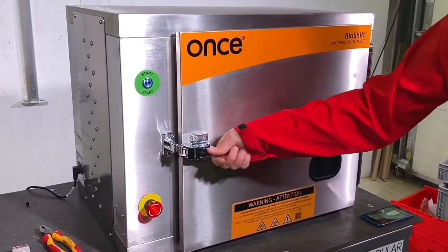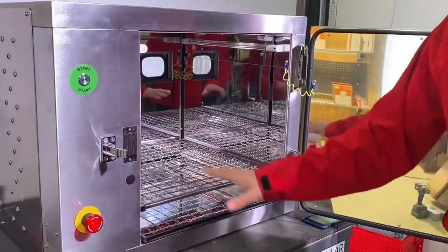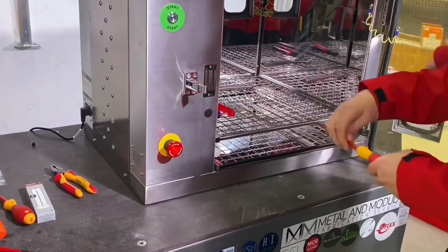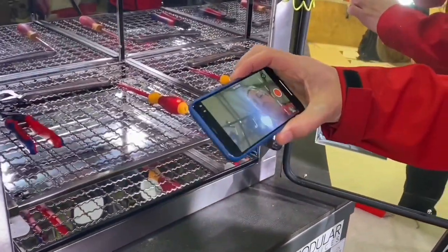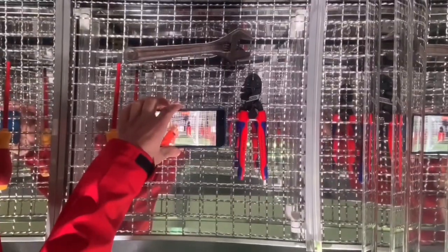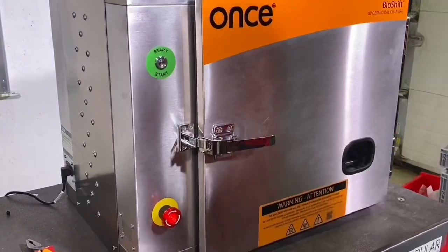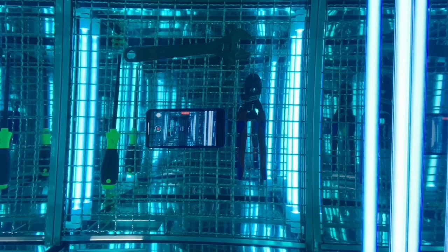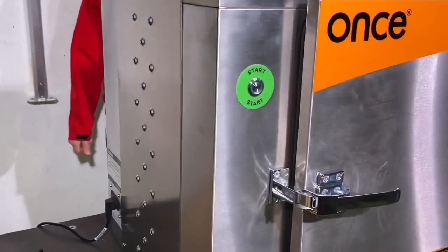Let's take a look inside our germicidal chamber. Opening the door, you can see it's highly reflective inside, which distributes the light from four UV tubes evenly around the chamber. Objects go on the stainless steel shelf. We're putting in some hand tools that need disinfection, and to prove this doesn't damage sensitive electronics, a phone is going in as well — recording throughout the cycle. Close the door, push the start button — that starts a one-minute cycle. You can see the light through the inspection window.